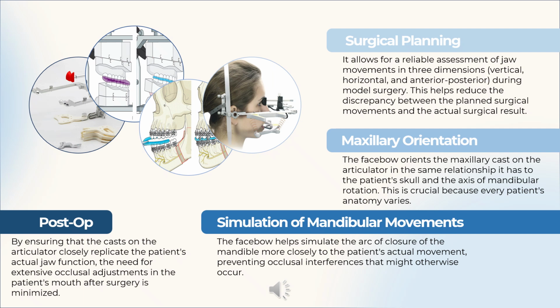and replicates the exact orientation from the patient's skull onto the articulator, which in turn improves the simulation of the mandibular movement as the lower jaw is closed onto the maxillary jaw. And it also improves the post-op results, so minimal occlusal adjustments are made post-operatively.